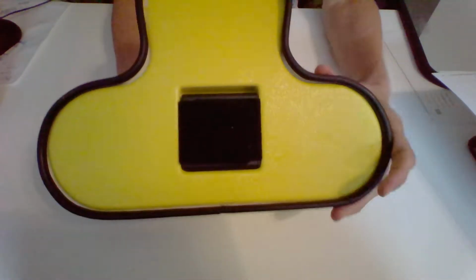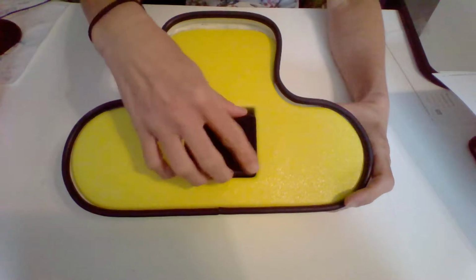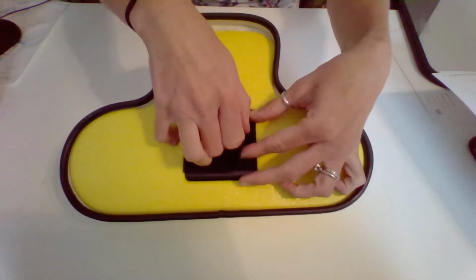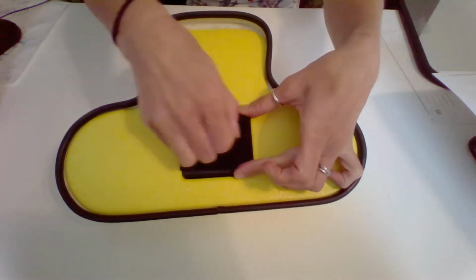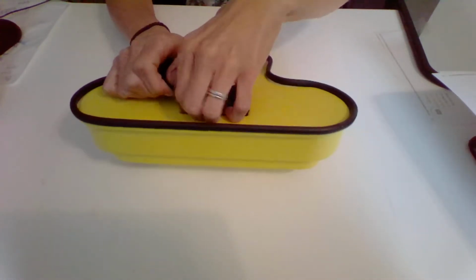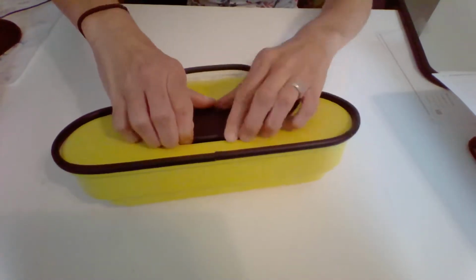If you turn it over, this is where your battery case is. You can't get into it from here. You can't pry this open. This is glued down. So if you need to get into it, you'd have to probably get a screwdriver and really get under here and break the glue off. So this is a very thick piece of Velcro right here. Okay, so you're going to open this up, and this is the box that contains the batteries. Now this is in here very snugly, so you kind of have to get your fingers in there and get it out.